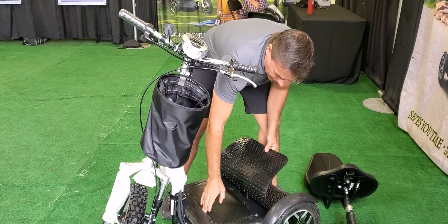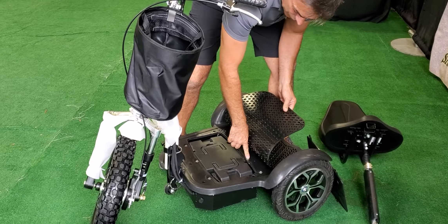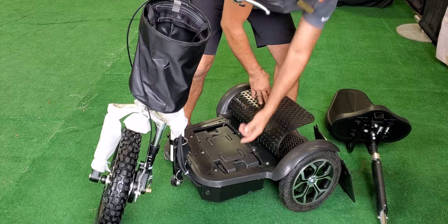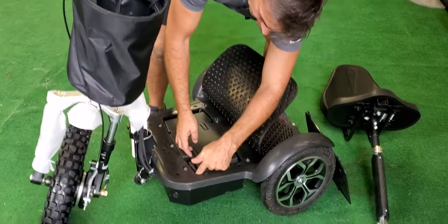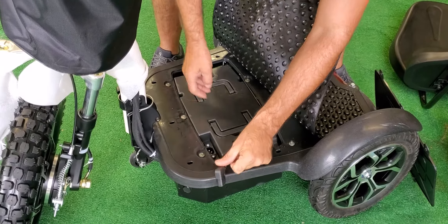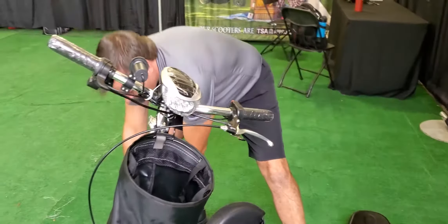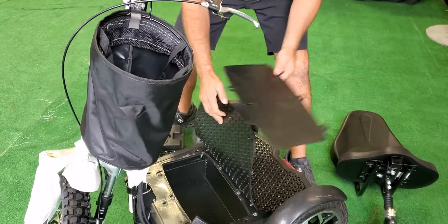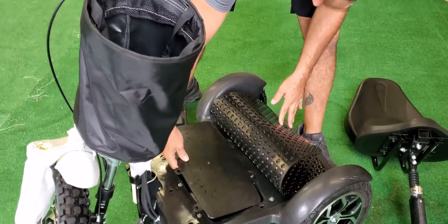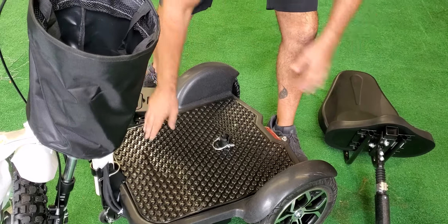Now the battery compartment is right under here. Remove the screws, put them back in, and lay that there because this will actually hold that in. To remove this cord, place your finger under here and that loosens it — you simply run this by the handle and separate that. After doing that, it's best to place this right back onto the compartment. That lessens the weight by almost half just removing this and the battery.